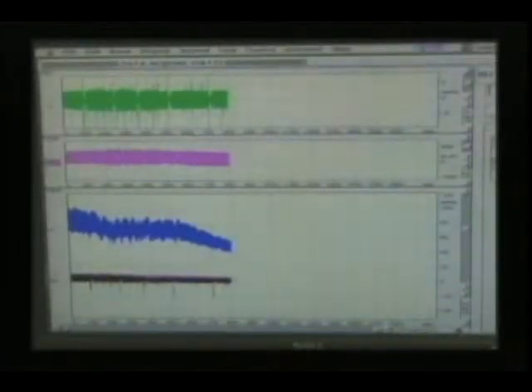We are now about halfway through the bleed. The aortic pressure is down to about 55 millimeters of mercury over about 40. The peak flow to the brain is down to about 300 ml per minute. The intrathoracic pressure varies between plus 2.5 and minus 2.5 millimeters of mercury. And the intracranial pressure and right atrial pressure also continue to decrease.